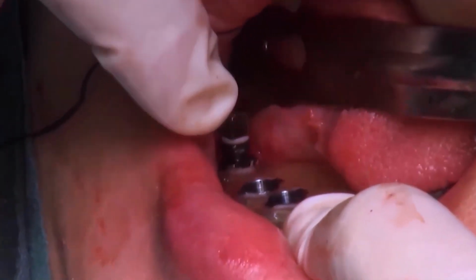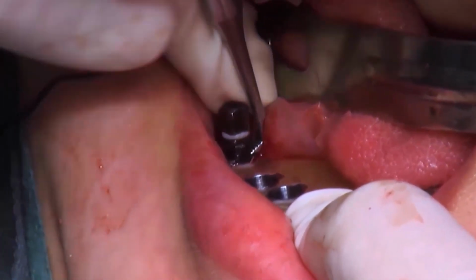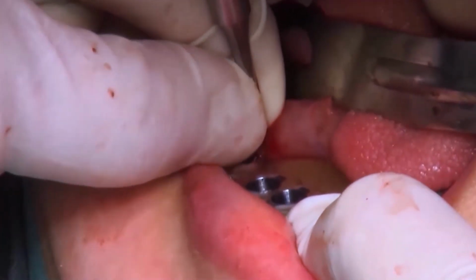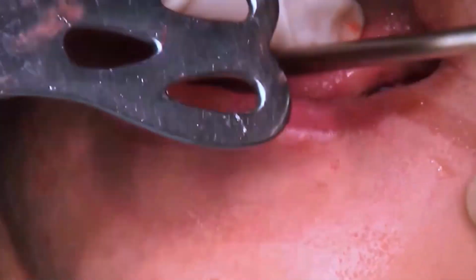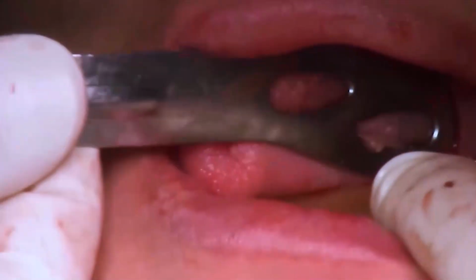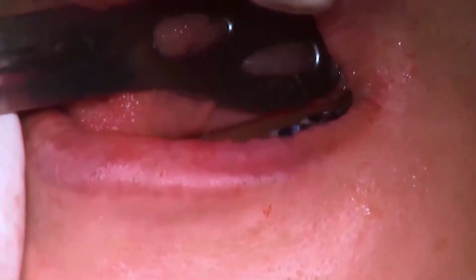I had difficulty in removing the implant connector. I use this crown remover to take it out. And then we moved to the other side of the mandible to drill and place implants.